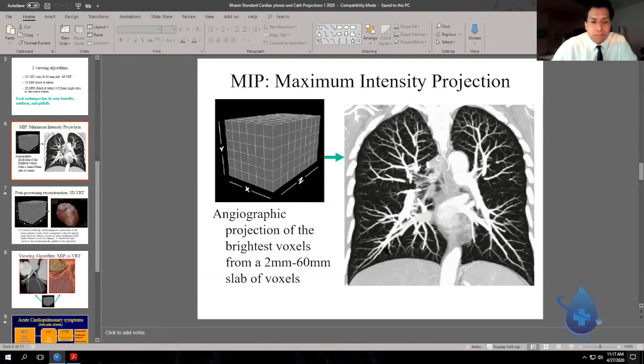You put it up the left subclavian or into the left carotid, and how do you know that you're there? You don't know, except your attending elbows you in the side of your lead and says, hey man, you just stuck it in the left subclavian, pull out. And I remember looking over and being like, I did? I don't remember that. You know, how do you know? How do you know is the curvature of the catheter.